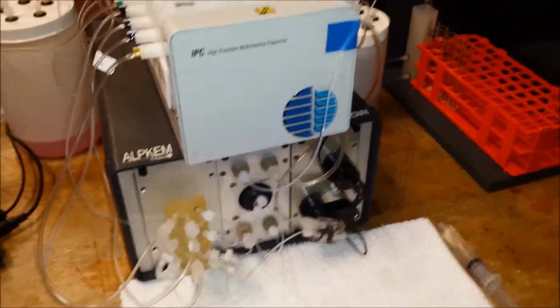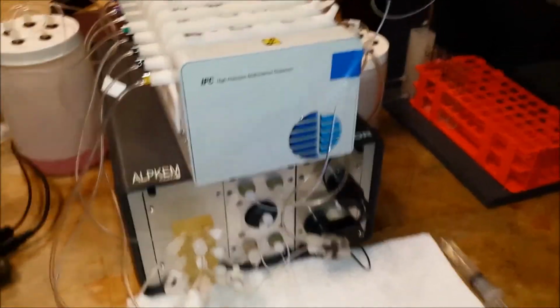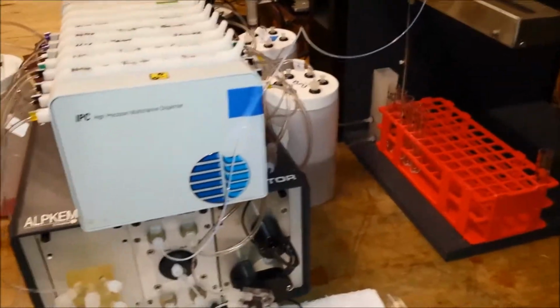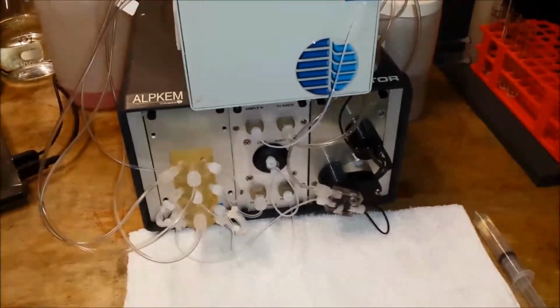We've injected air into the loop and we've seen that that air goes into the cartridge. So we know that the sample's being communicated into the system, but what we don't know is why we're not getting peaks. So our recommendation is to inject a higher than normal standard than you normally would run on the system. In this case, we're running nitrite and we're going to inject a 10 ppm standard in, because what will happen is for sure we will see a very strong pink color.